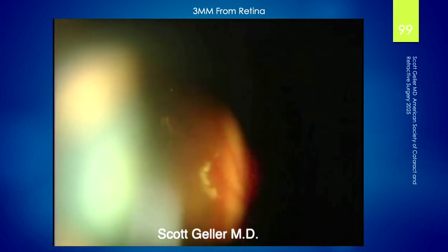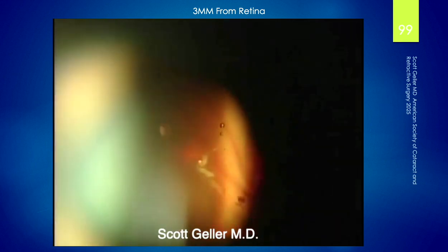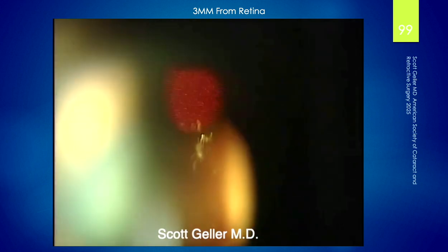So you can see this is very close to retina, very close. That can't be more than a few millimeters from retina. But if you're careful, you can get it with the right laser, the right technique. And you can see I'm jiggling the eye a little bit. Every time I jiggle the eye, it lets the opacity become more anterior because I'm trying to cut some supporting strands of that opacity. We got it, though. There we go.